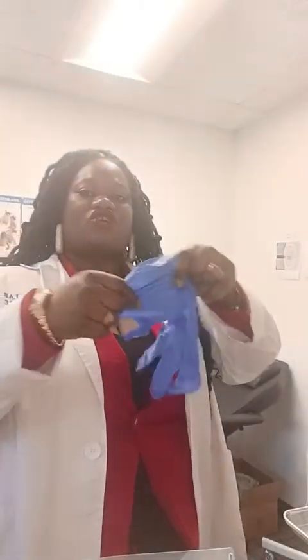All right, now what I'll do next, I'm gonna go ahead and do my split collection. I'm gonna make sure I have my gloves on. I say glove, pair of glove. Make sure you always wear your glove. At this point, you gotta put on your glove, because now you want to touch the urine.